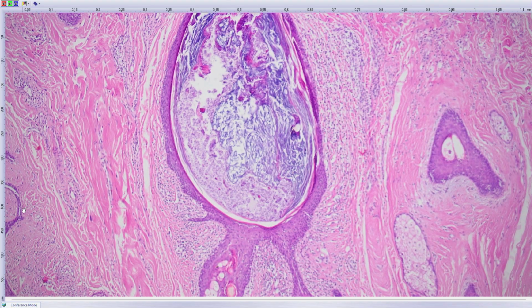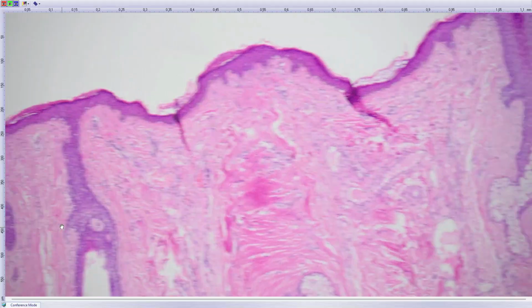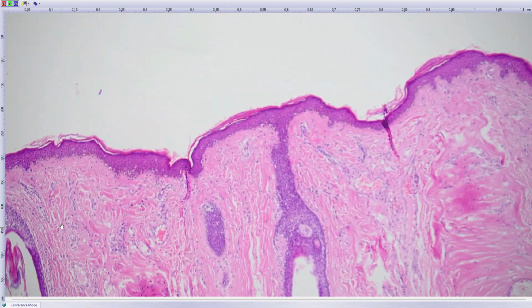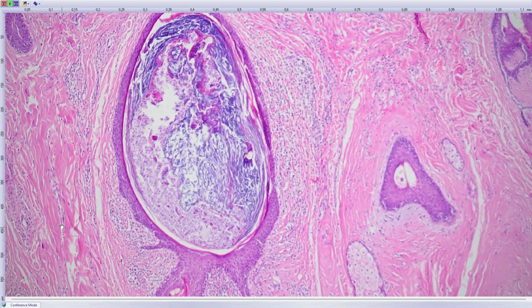I don't have the footprint here. Next time I will show it to you. So, this is the real Birt-Hogg-Dubé syndrome with tumor of the kidney. Again, it's sebaceous proliferation and fibroma-like proliferation around these epithelial structures, which are retinoblastoma protein positive. And a similar-looking but entirely different lesion is spindle cell lipoma with sebaceous proliferation. Spindle cell lipoma is typically retinoblastoma protein negative. There is a deletion of it.